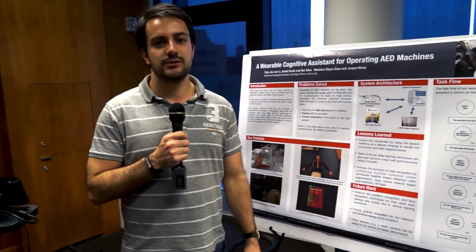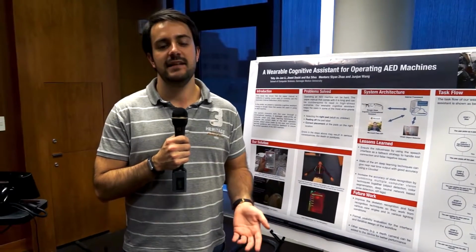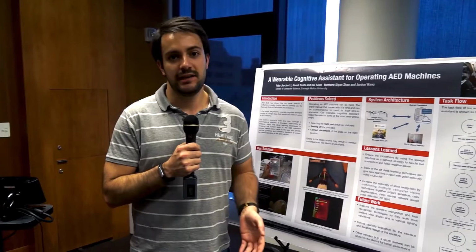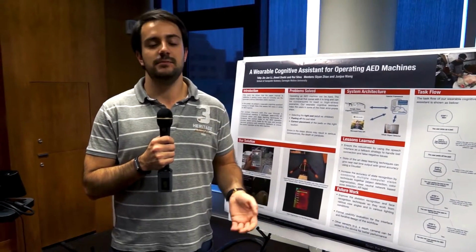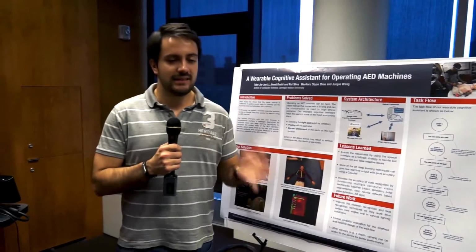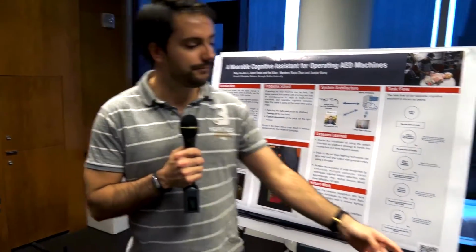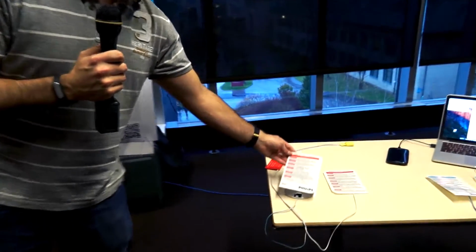In our project, we're trying to design a virtual assistant that helps users by guiding them on how to operate an automatic external defibrillator, or AED machine. The AED machine is a device that helps save people's lives, and as such, it is typically used in high-stress scenarios. Even though the instructions of this machine are somewhat simple, users still make lots and lots of mistakes.